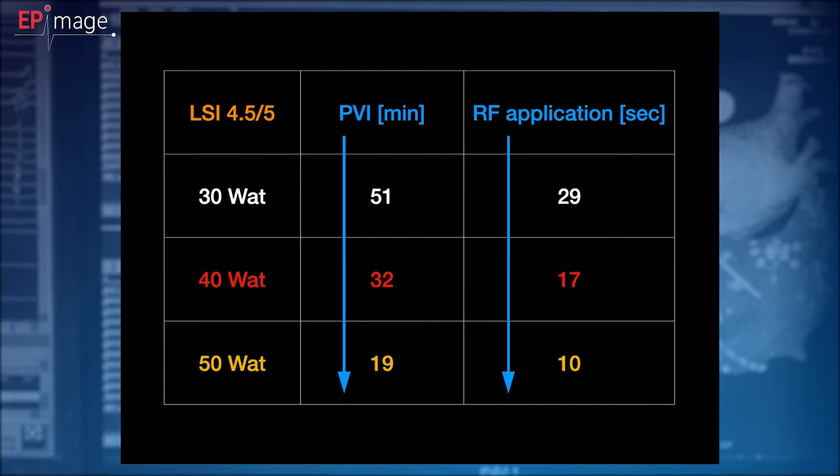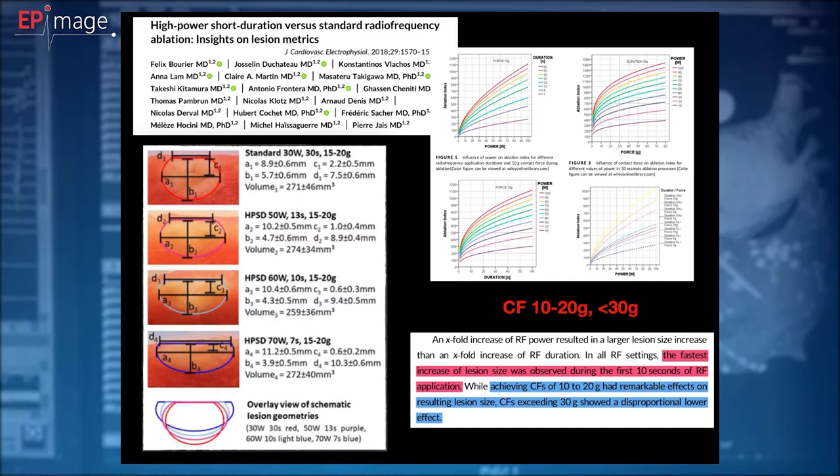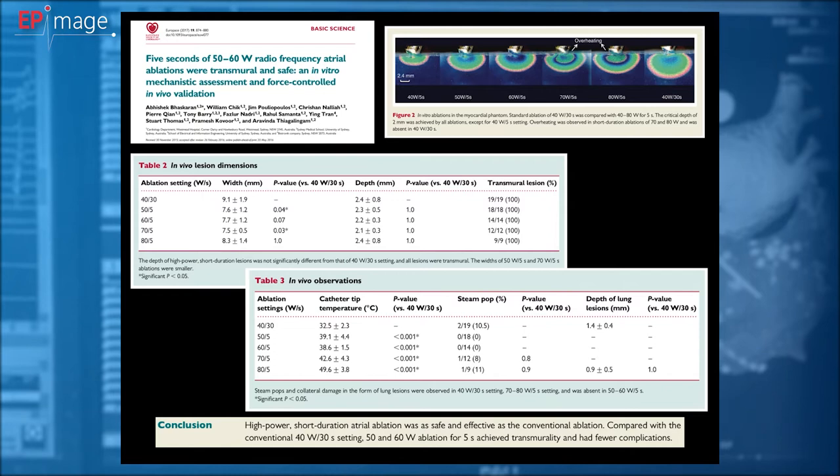Previous studies show that lesions done with high power energy settings are shallower but wider than the lesions done with standard settings. Still, these shallow lesions are deep enough to reach transmurality in left atrium, especially on posterior wall. We also know from in vivo validation that 50 watts ablation is safe, and steam pops started to appear when the settings were over 70 watts with radiofrequency ablation lasted 5 seconds. So using 50, 60 watts, we were on a safe side.